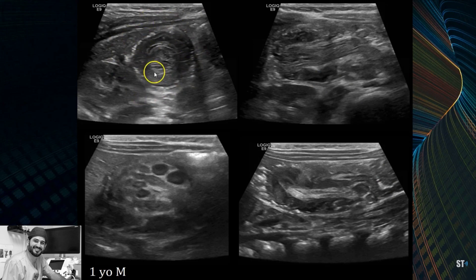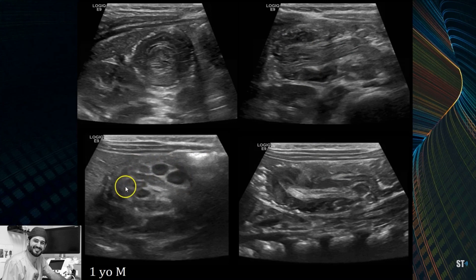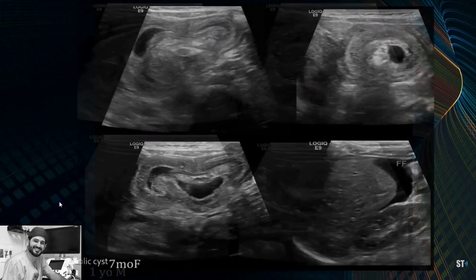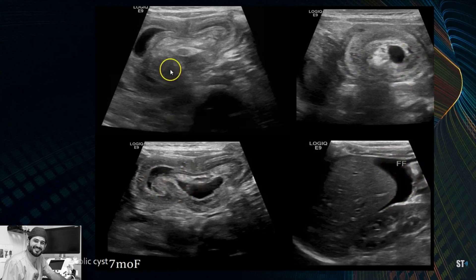Here's another case: a one-year-old male with the intussusception in the right upper quadrant. You can see the right kidney, a piece of liver, the target lesion in transverse, and then the longitudinal view showing the large bowel outside and the ileum within it, along with multiple lymph nodes. You will often see lymph nodes within or near the intussusception. In another case, the wall looked heterogeneous with small cystic spaces and there was free fluid — an abnormal appearance.